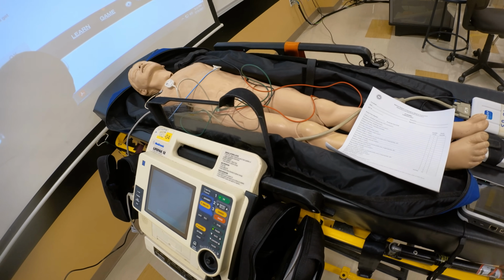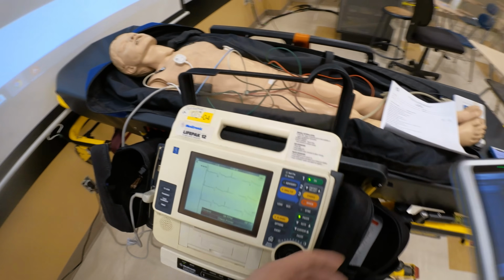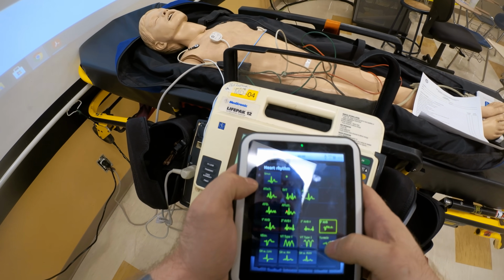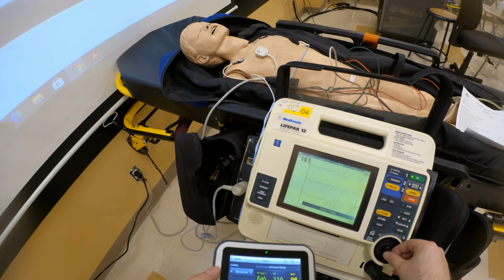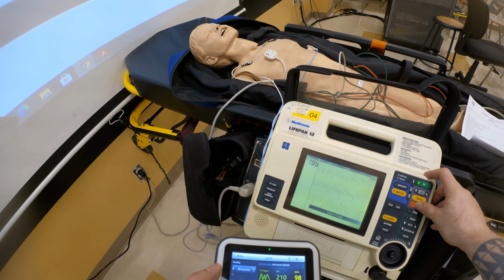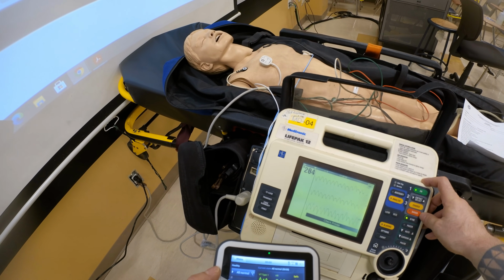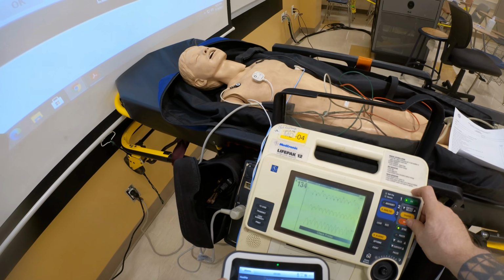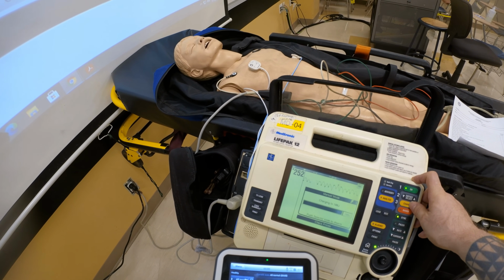this is actually very common, right? They'll say, all right, I am going to perform synchronized cardioversion, right? And let me put the rhythm here. And what they will do, they'll say, okay, I'm going to select my energy. I'm going to start at 100, and they'll say, okay, everyone's clear. I'm going to write sync, and then they will say shock, but there's no shock delivered. The main thing that they tend to do is they forget to charge. So they forget to press the charge button, right?